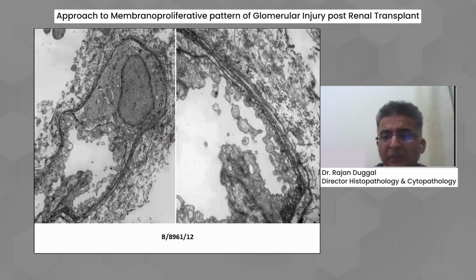In addition to that, when you look at the peritubular capillary, this is a low magnification of a peritubular capillary. Look at this PTC. There are multiple layers. You can see 1, 2, 3, maybe possibly 4, 5, or 6. If you find 5 to 7 layers or more, one PTC with more than 7 layers under ultrastructure examination, that is consistent with a chronic antibody process. So this case is not showing C4D staining, but it is showing duplication. It is showing evidence of transplant glomerulopathy.